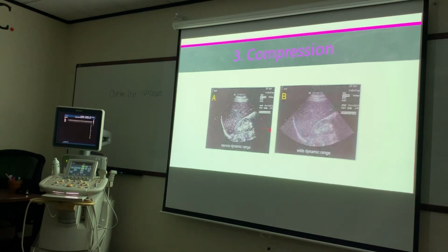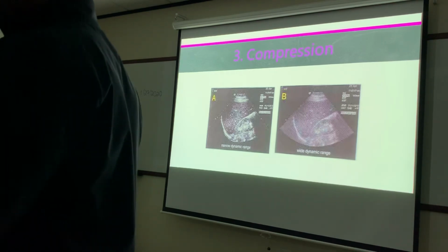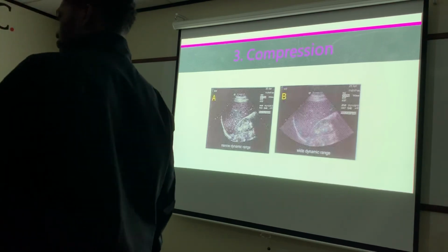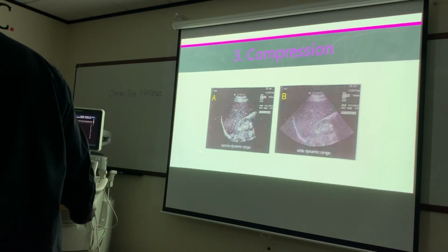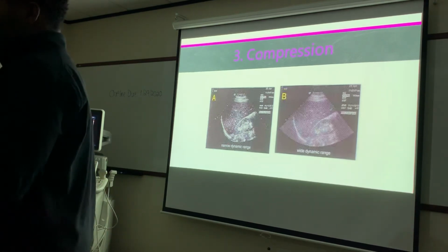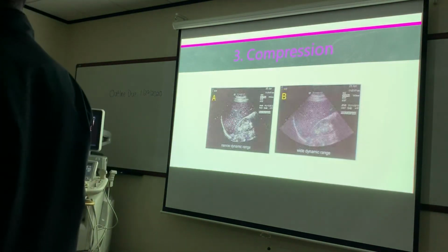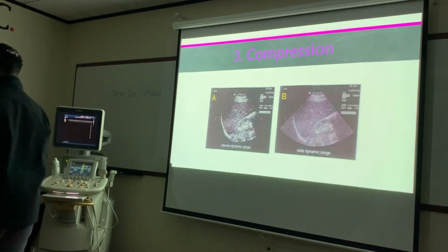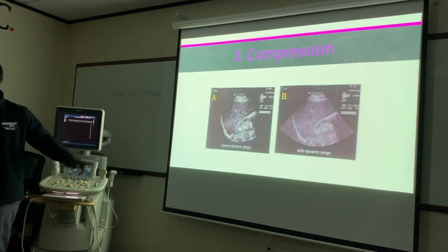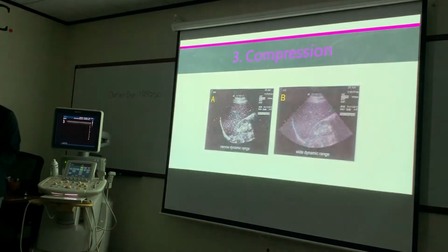And we have a wide dynamic range right here. Why? Because we see so many shades of gray. It's so grayed out. Narrow will be the more black and white one. It's narrow because it has extremes. It's either black or it's white. There are not many shades of gray within that. The field of view doesn't change, that has nothing to do with it. We're talking about dynamic range.